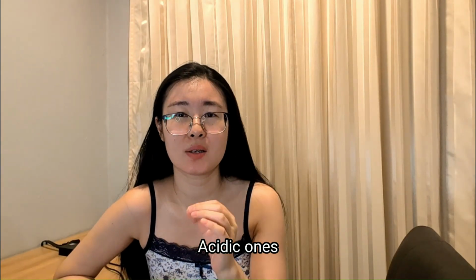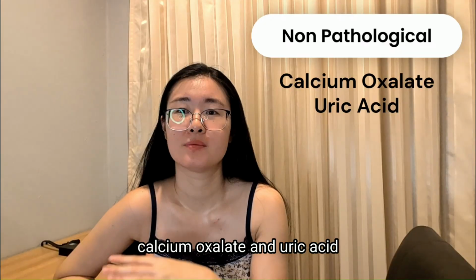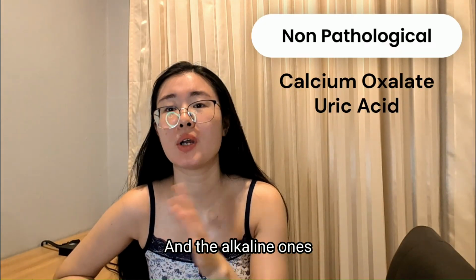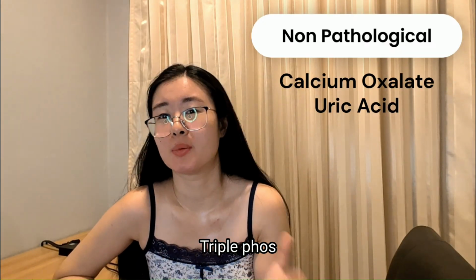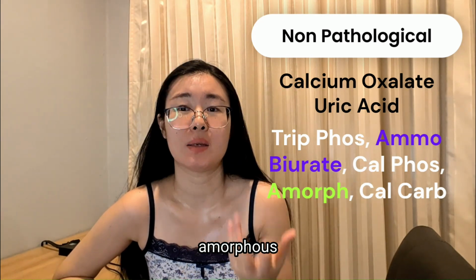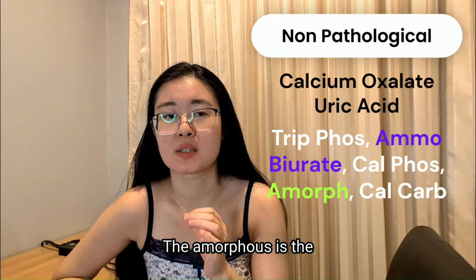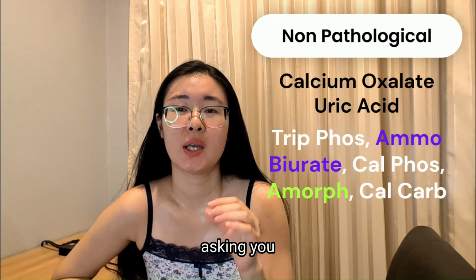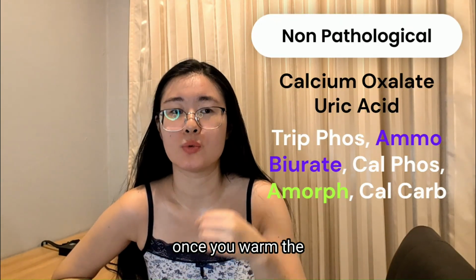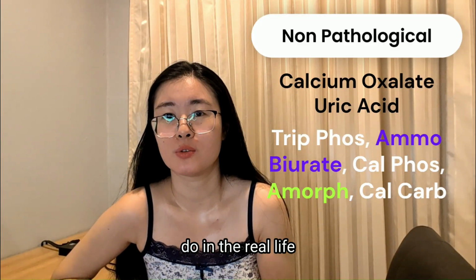Non-pathological ones. Acidic ones, you got two: calcium oxalate and uric acid, and that's it. And the alkaline ones, well, you get a lot: triple phos, ammonium biurate, calcium phosphate, amorphous, and calcium carbonate. The amorphous is the one the test will ask you if it will dissolve once you warm the urine up. And the answer is yes. That's also what you do in real life too.